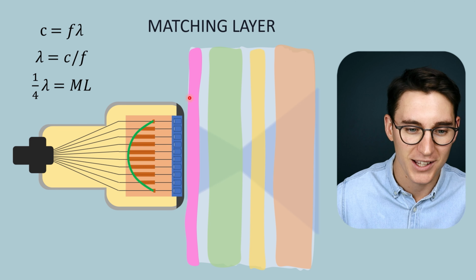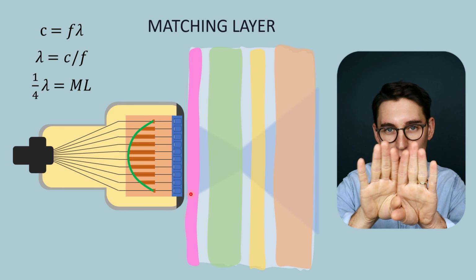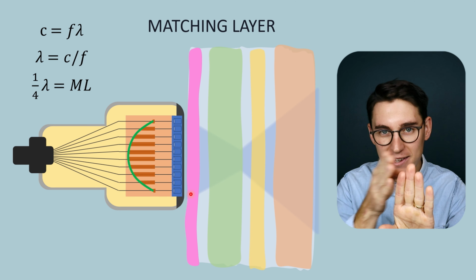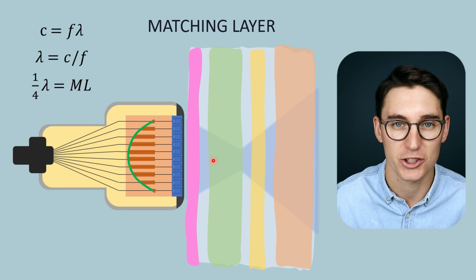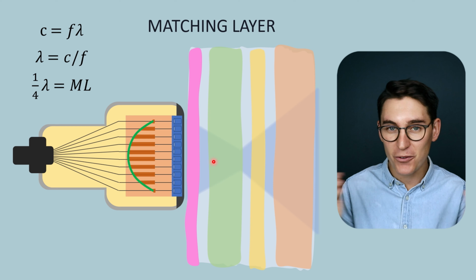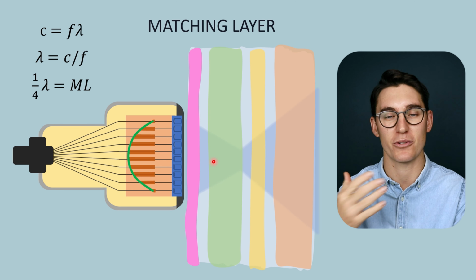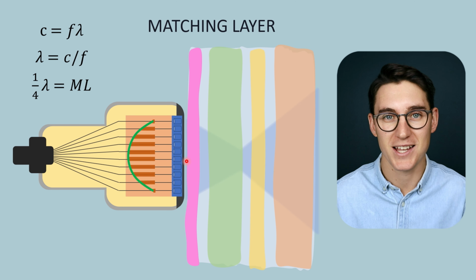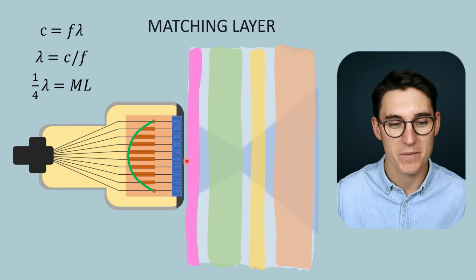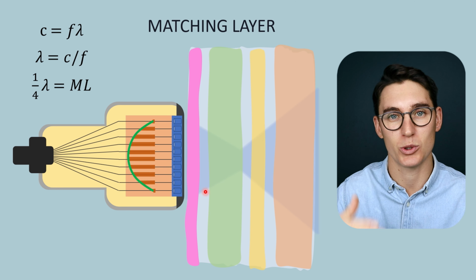Now, there's a problem here. Skin or tissue is not perfectly smooth and won't perfectly match with our matching layer. There will be air pockets between the matching layer and our soft tissue. And we've seen that the difference in acoustic impedance will determine how much of those sound waves are reflected back. And because air has such a low acoustic impedance, the differences will be very high, and we will struggle to get sound waves to be transmitted into our tissue.